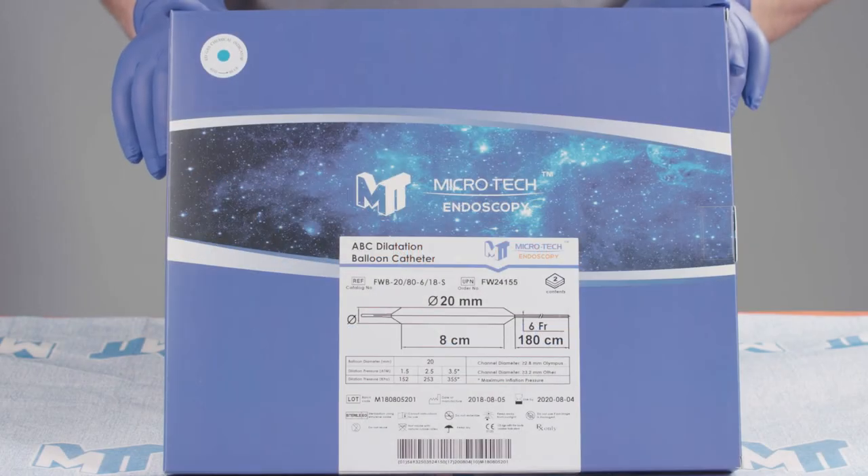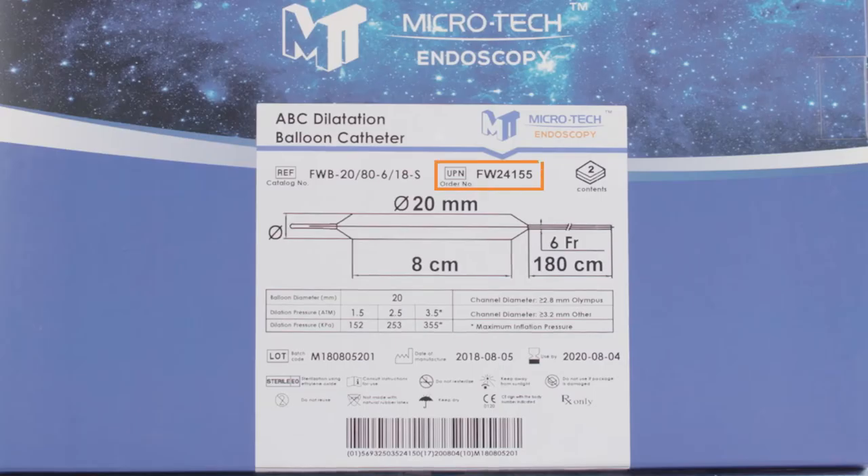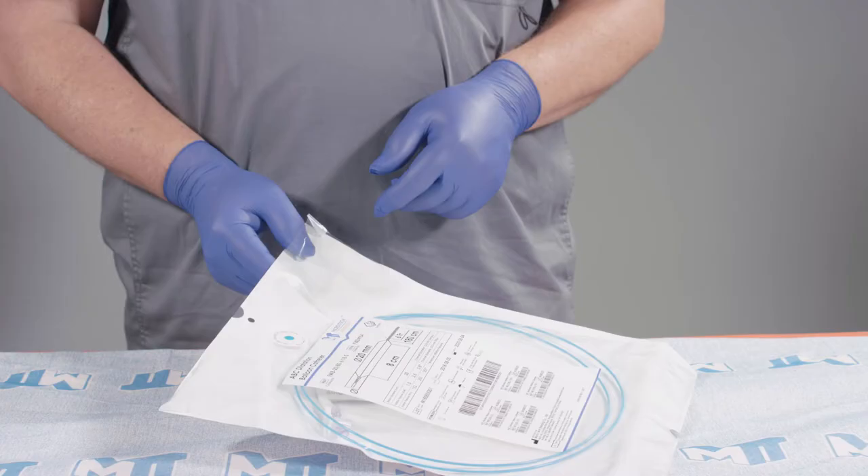The Microtech ABC Dilation Balloon Catheter comes packaged sterile, two per box. The labeling includes the order number, the product size and specifications, date of manufacture, and use by date. Each ABC Dilation Balloon Catheter is packaged in a plastic peel pouch.